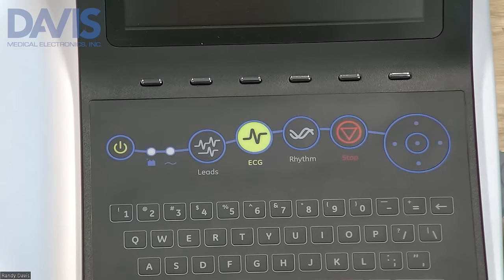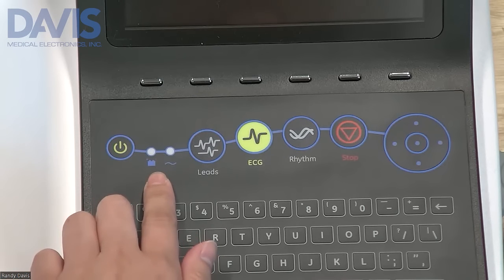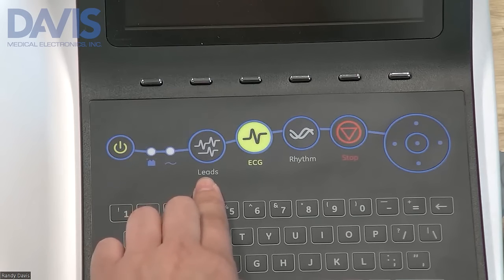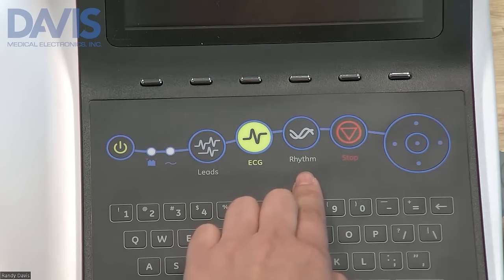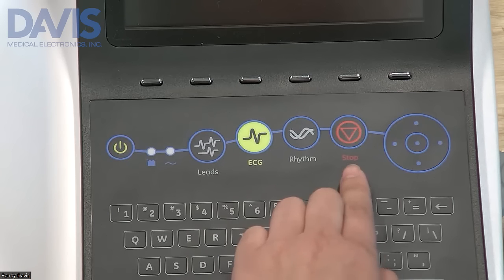On the surface of your device you have your dashboard buttons. On the left side you have your power button, your power and battery LED indicator lights, your lead key to allow you to scroll through different lead options, your ECG key to allow you to acquire a 12-lead ECG, your rhythm key to allow you to take a continuous ECG, and to stop your rider you have a stop button.